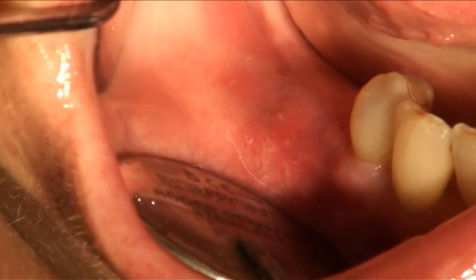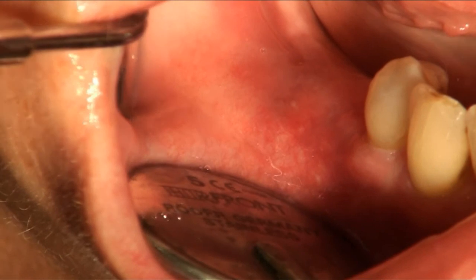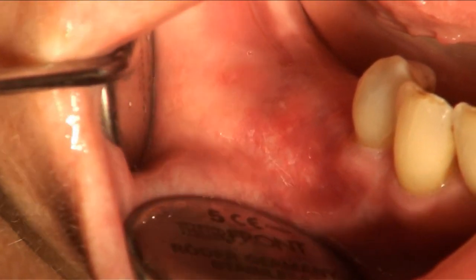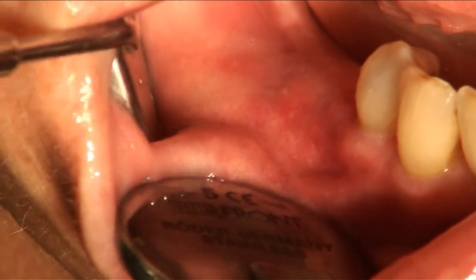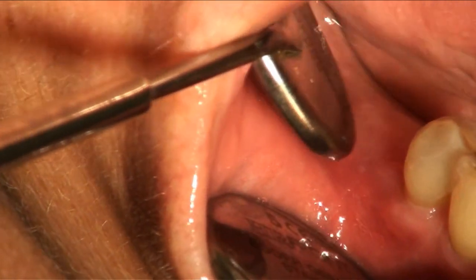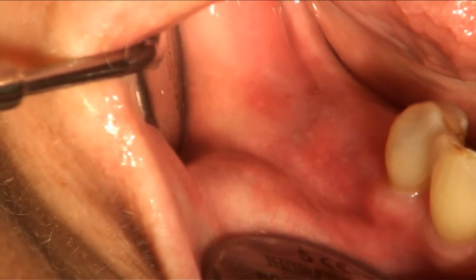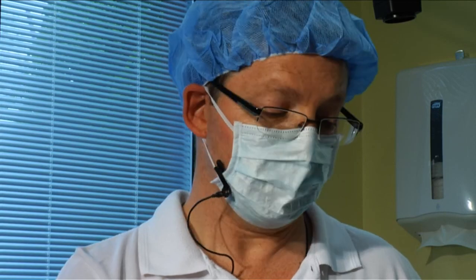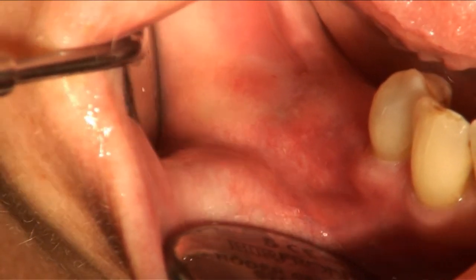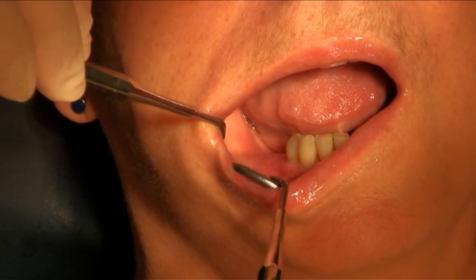So intraorally we now see the situation with the expander inside the soft tissues, demonstrating the extension already occurred in this area in the mandible, posterior right side, where we will have to apply an autogenous bone block transplantation from the posterior side to the anterior, where the teeth are missing from number 5 on. Okay?